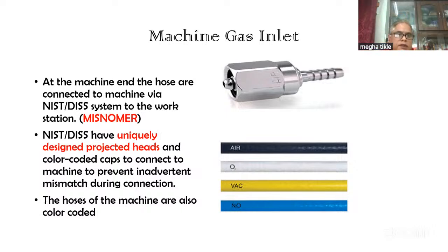So they have uniquely designed projected heads and color-coded caps to connect to the machine to prevent any mismatch during connection. As I said, the hoses are also color-coded, so we can identify which gas and where we have to attach on the machine.